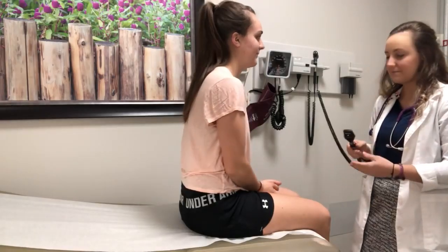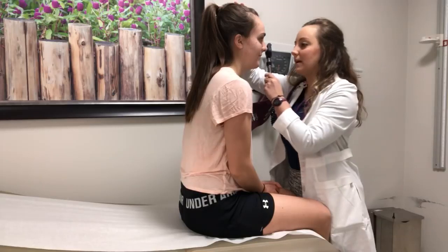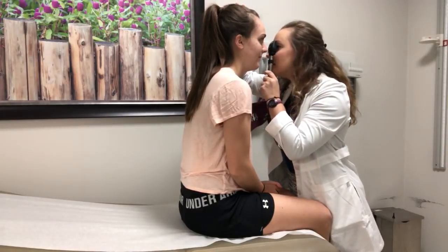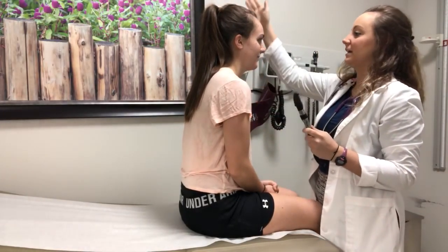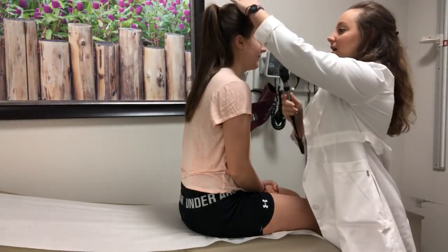Okay? Okay. So left eye. I'm going to look at your left eye. Okay? Good job. I can see her disc, her macula, her red reflex was intact, and I can also see all of her blood vessels, okay? So now I'm going to check this eye.